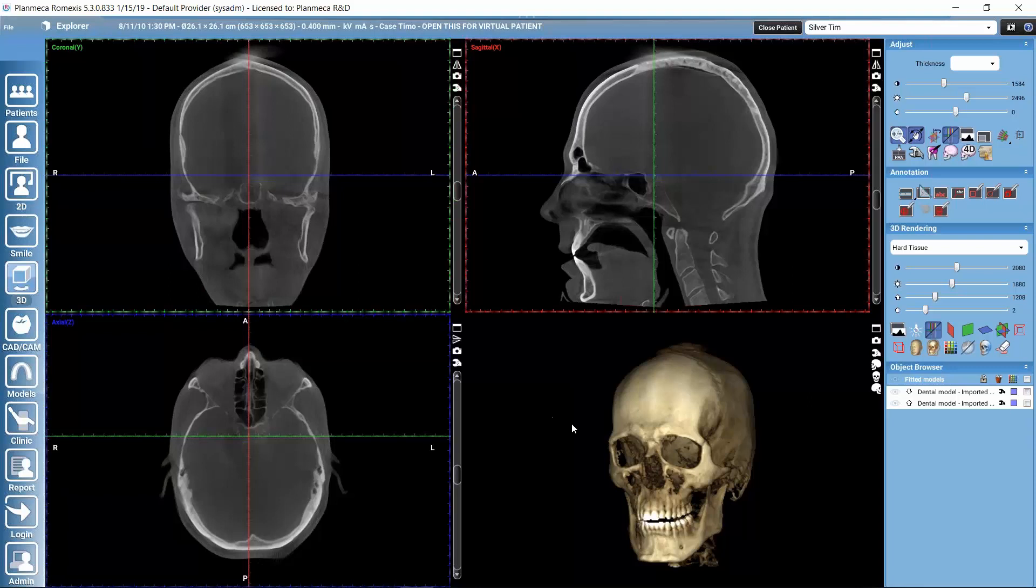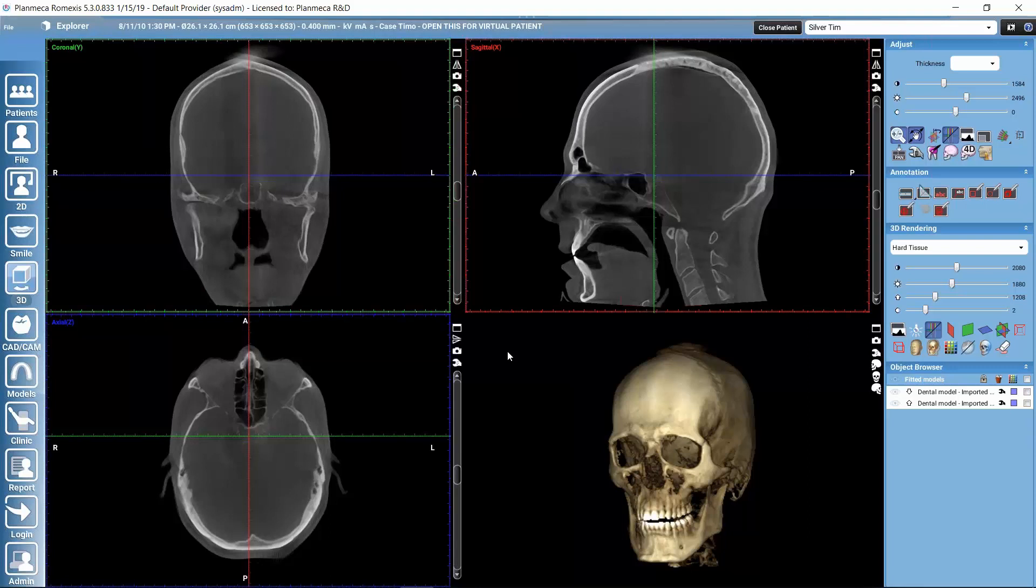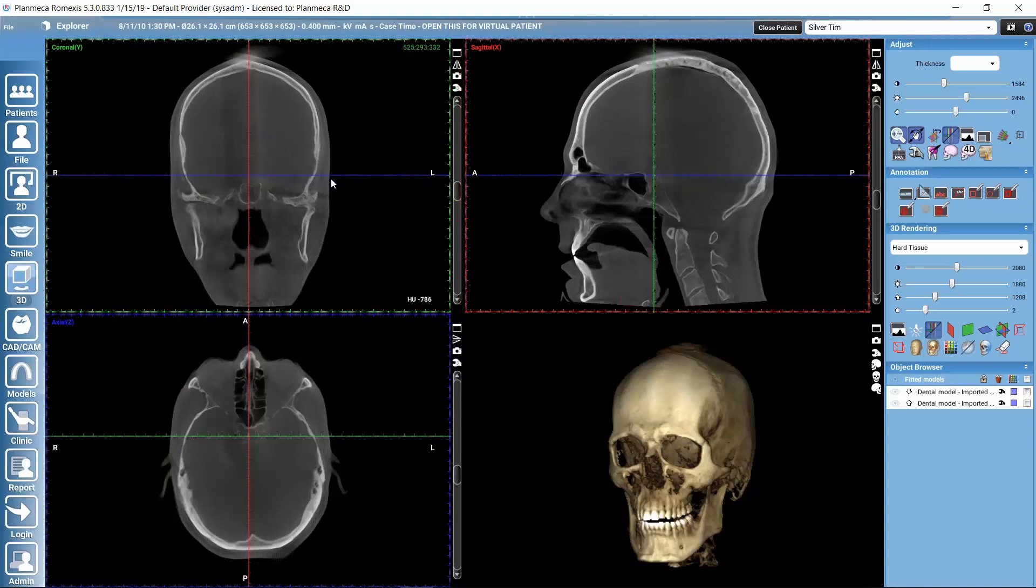Let's start here with this bigger volume that has the temporomandibular joints visible in the Explorer submodule. This is the default submodule where all the data gets opened and where we can see that after capturing or importing it. First, if we would need to align the volume a little bit because we don't have all of these views available in the TMJ submodule.